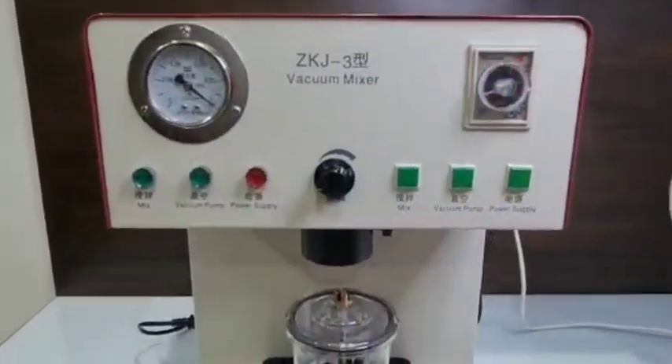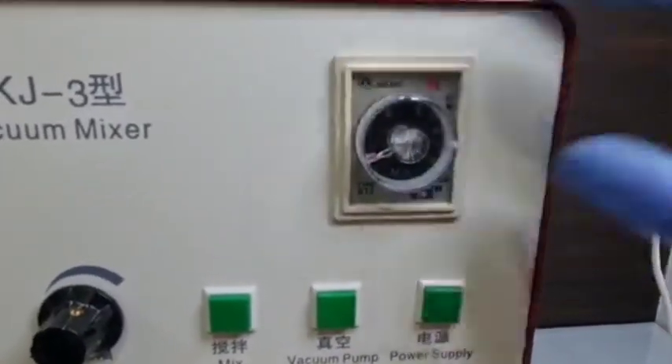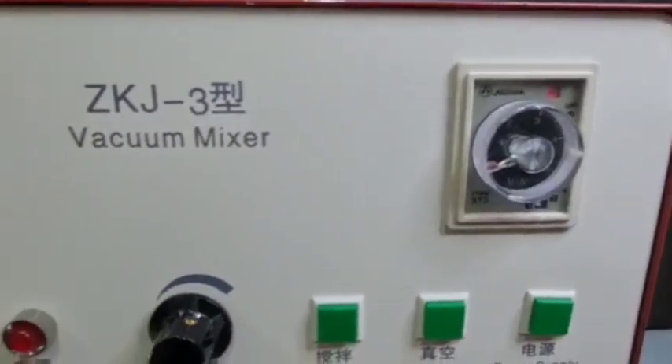There is a digital timer on the extreme right, which is in minutes. You can set the timer according to your requirement. The machine will automatically stop once the timer is reached.